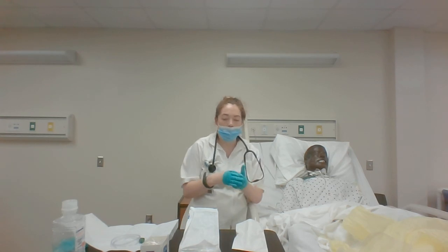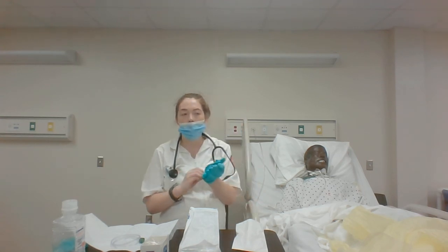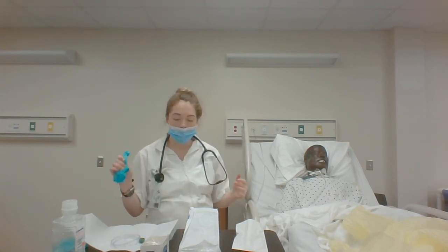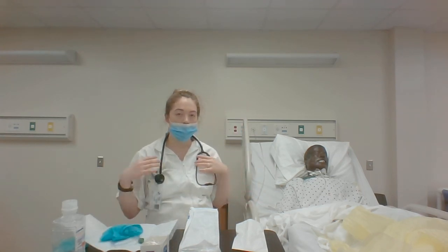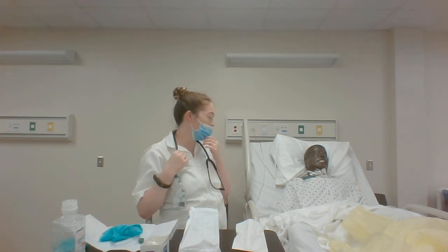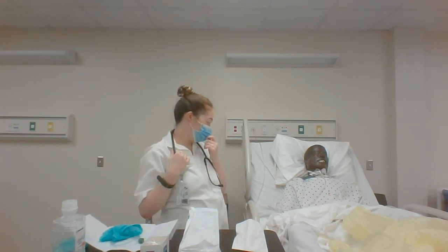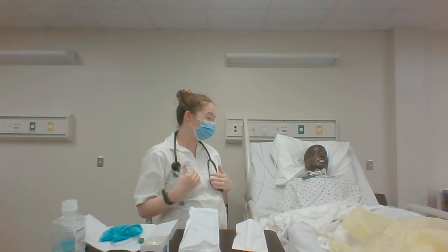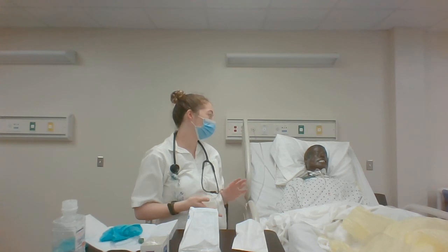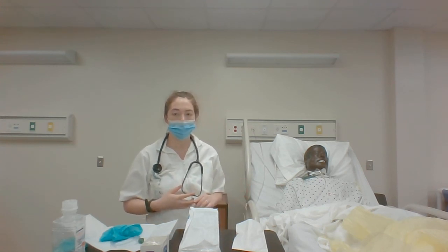I would then take off my gloves and wash my hands, and document the patient's tolerance to the procedure, the secretions, and the lung sounds before and after the procedure.